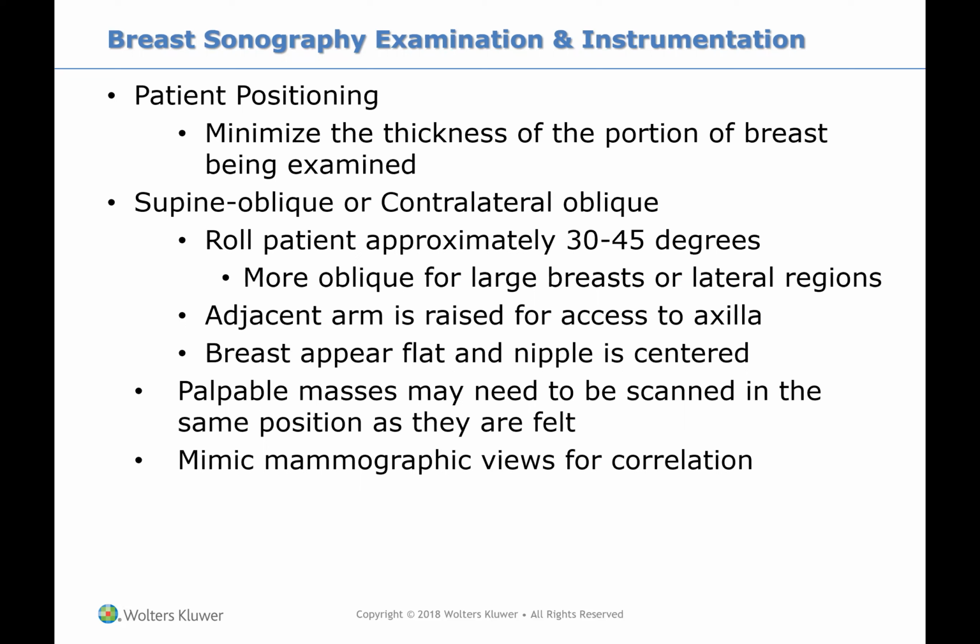The other thing I do is I have them raise their arm so you can see the axilla area. And that'll help the breast become more flat. But if there is a palpable mass, a lot of times, whenever they can feel it, depending on if they're laying flat or laying a different way, that's the way that you want to scan.